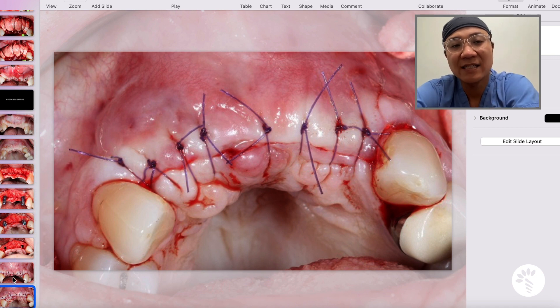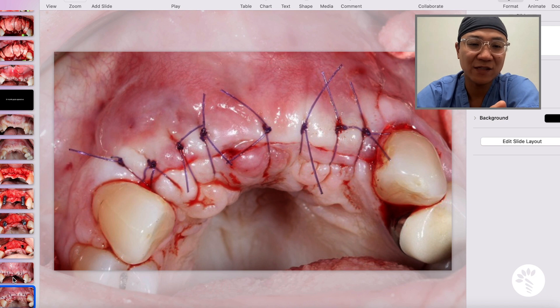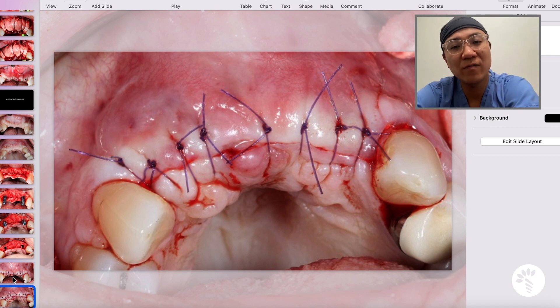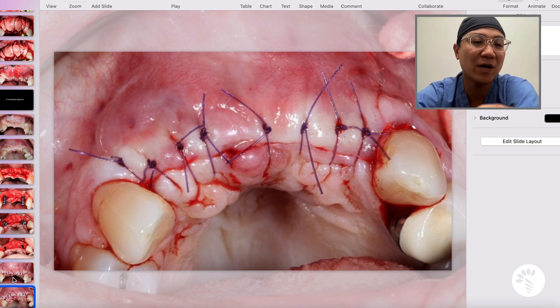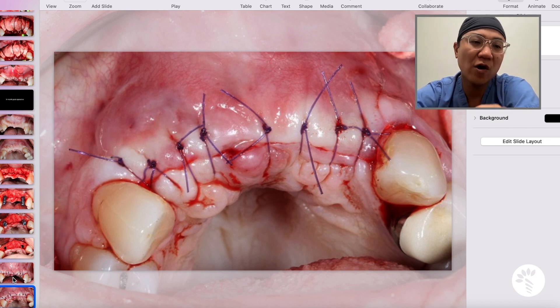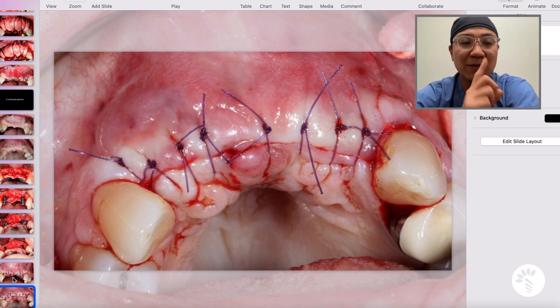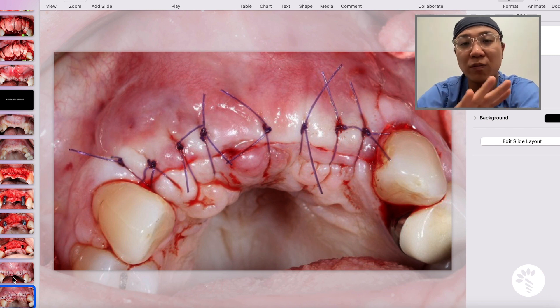The key for this case is to understand when you want to separate doing a minimally invasive extraction and bone graft from elevating a large flap. Another important point is how long we waited — almost six to eight months — because this is a large augmentation procedure. A predictable bone augmentation can be achieved if you give enough time, and if the right materials are used correctly — especially how I fix the membrane completely so that the membrane and bone graft are completely immobilized.